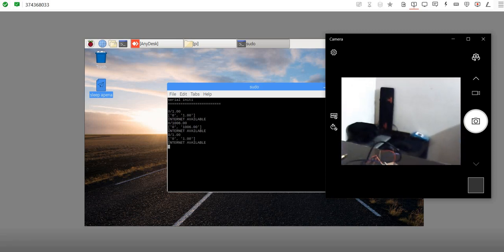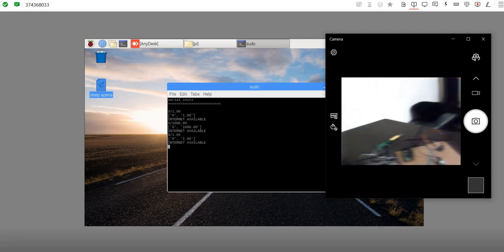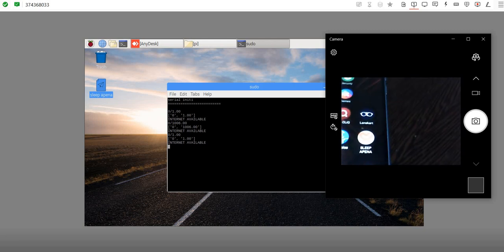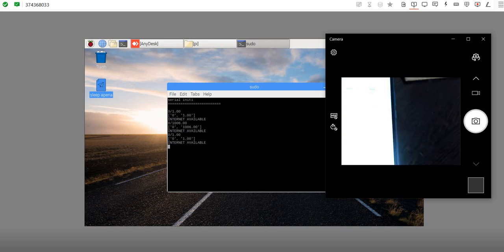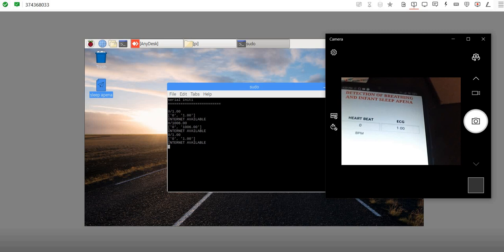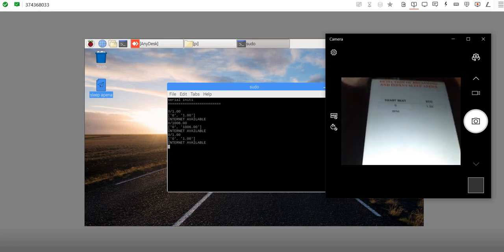And on the mobile phone side you will have an icon called Sleep Apnea APK. Just install that APK, and whenever we open it you can see that it will give you the heartbeat and ECG values as we received from this part.